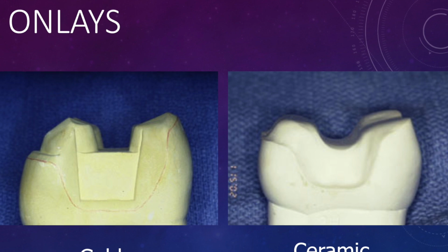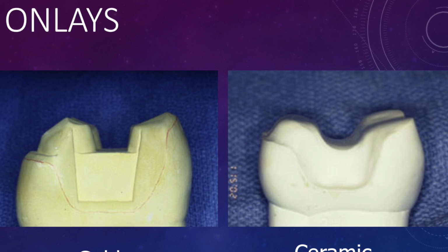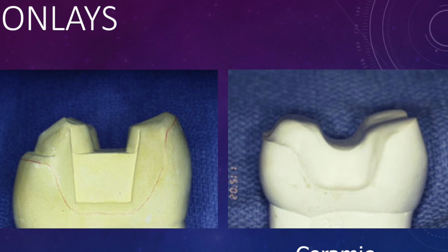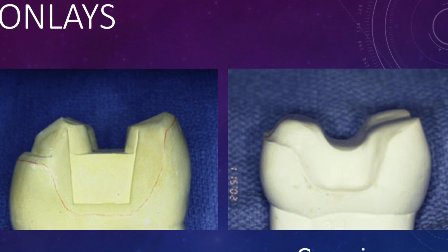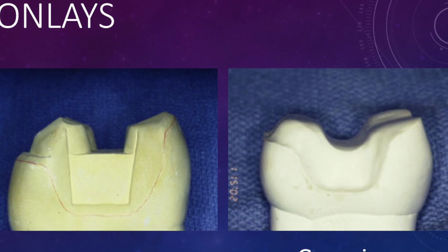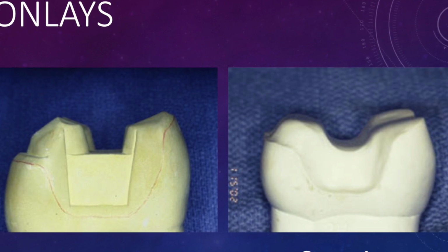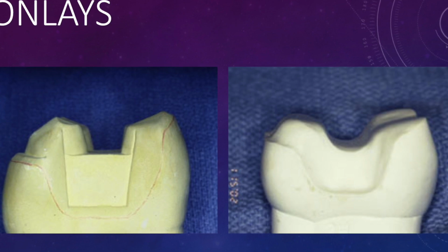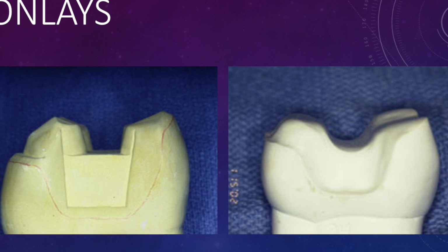The diagram on the right outlines a very different preparation. It does have a flowing outline form on the external, but it also has very smooth internal features. No sharp edges as we transition from an incline to a vertical wall, or from a vertical wall to a pulpal wall. All of these areas are smoothed off. And perhaps this is one of the most important steps at the end of the onlay to make sure that the ceramic is not going to be undergoing unreasonable amounts of stress. Let's go ahead and get started on the preparation.